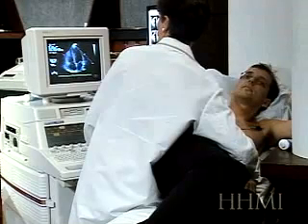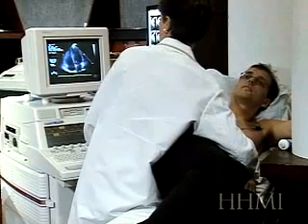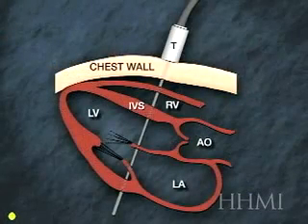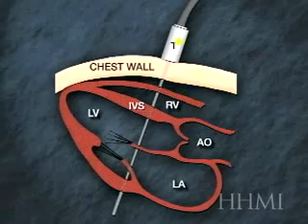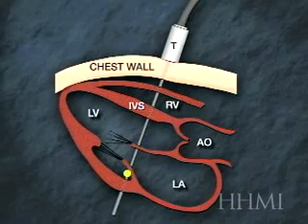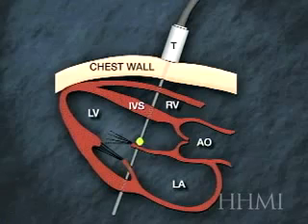On our last slide, I'm just going to show you a schematic of how we are going to look at the echocardiogram. The transducer is placed on the chest, and a sound wave passes through the right ventricle, through the interventricular septum, and into the left ventricular area. In real time, this structure is moving, and we should be able to see that now.